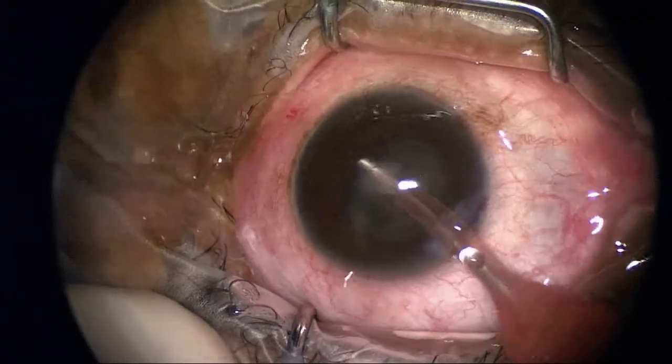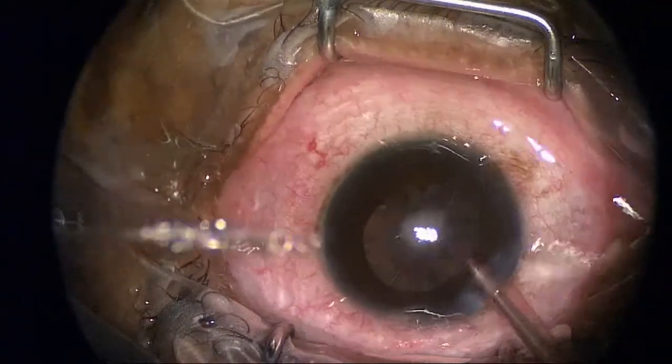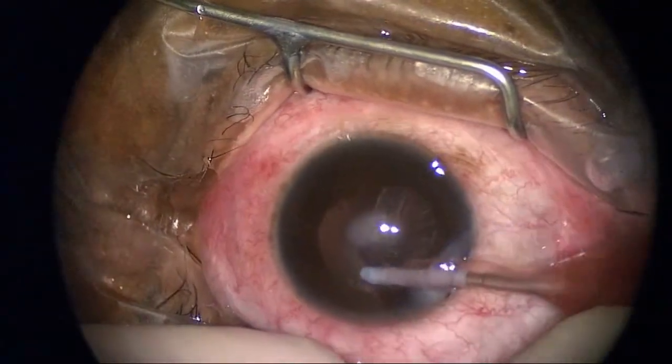This is an ultrasound phacoemulsification procedure. Toward the end here I'm going to go ahead and remove the sub-incisional residual cortex first.